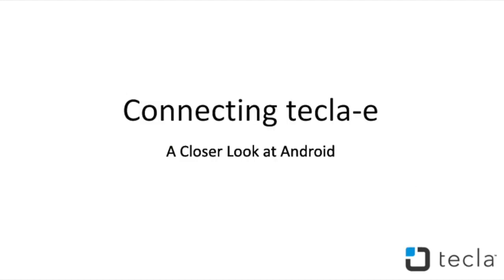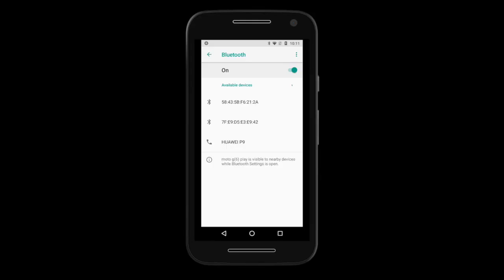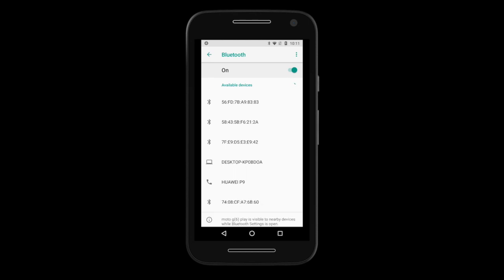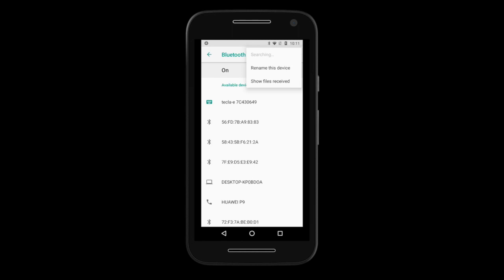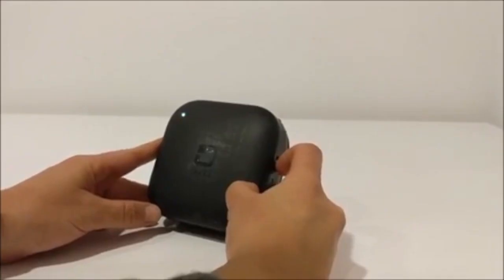Let's pair and connect our Tecla E. To begin, go to Settings, then go to Connected Devices. Next, select Bluetooth. Once you are in the Bluetooth screen, you can put the Tecla device in pairing mode by pressing and holding the on-off switch to gear position for 3 seconds.